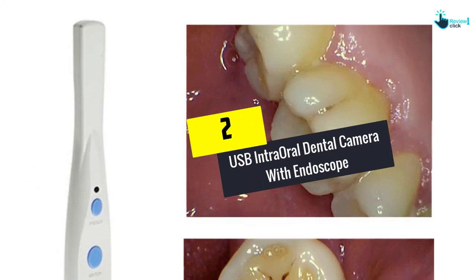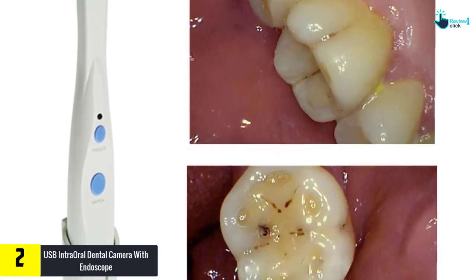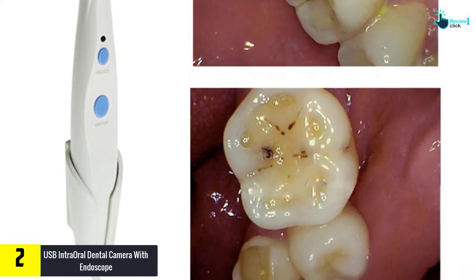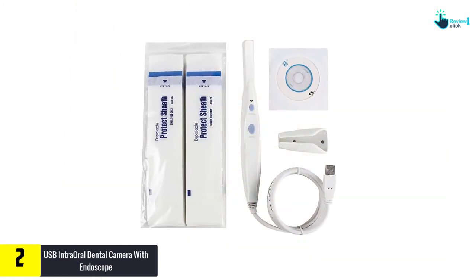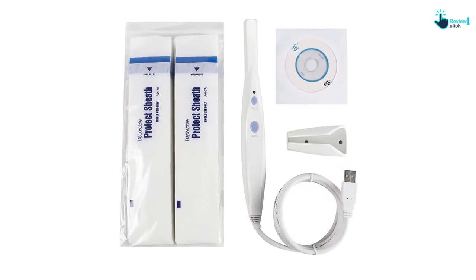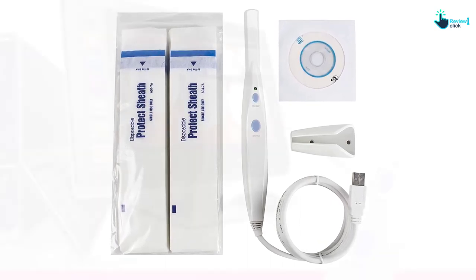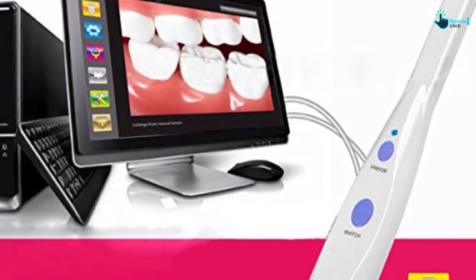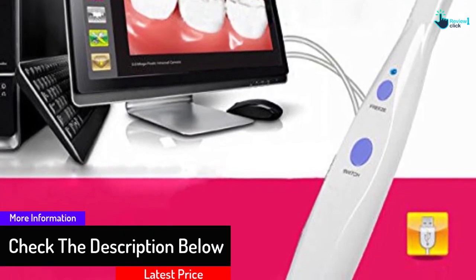At number 2 we have the USB Intraoral Dental Camera with Endoscope. Available in a complete set, it includes a magnetic camera holder and a software CD. The camera comes with brilliant LEDs and has automatic white balance. It can automatically fill the light for a convenient experience. It features a 5 megapixel camera and a simple USB connection that lets you connect directly to your computer and view results on a large screen. No drivers are required to install.